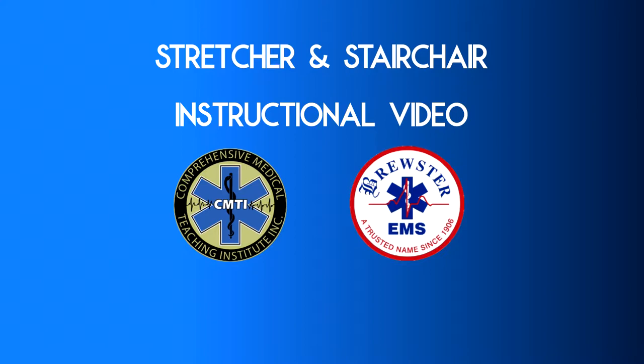Hello and welcome to this instructional video regarding stretcher safety and proper use. This video will demonstrate the proper techniques in securing a patient, transporting that patient safely, and loading the patient safely into the ambulance. This video will also demonstrate proper lifting techniques and the art of teamwork in order to make sure every team member completes each call free of injury.